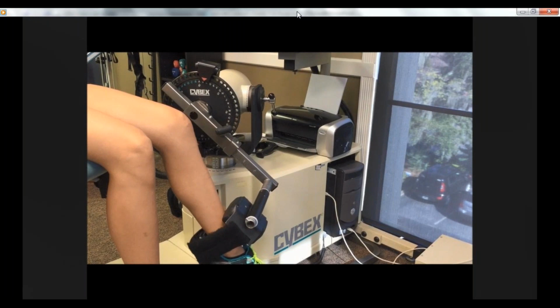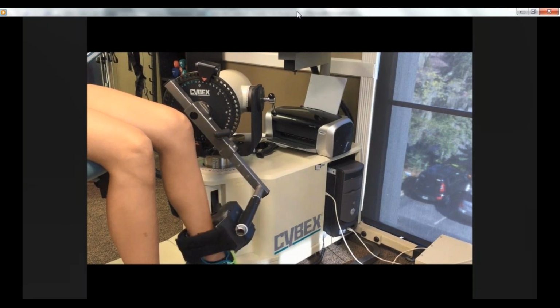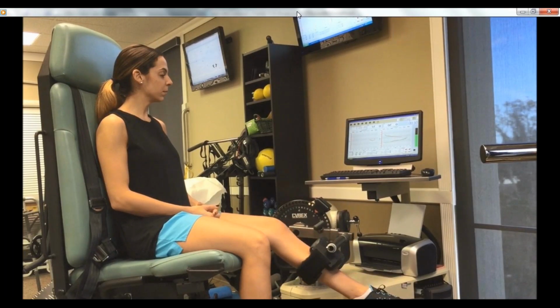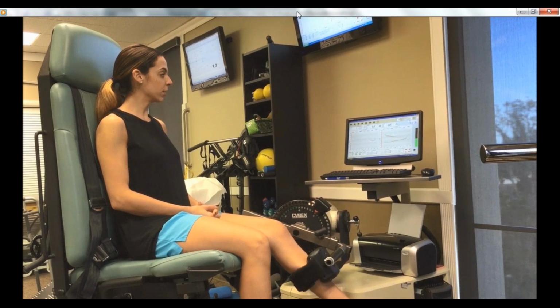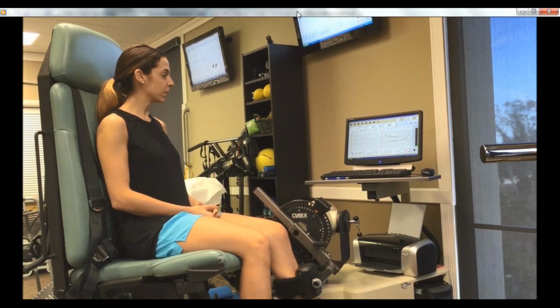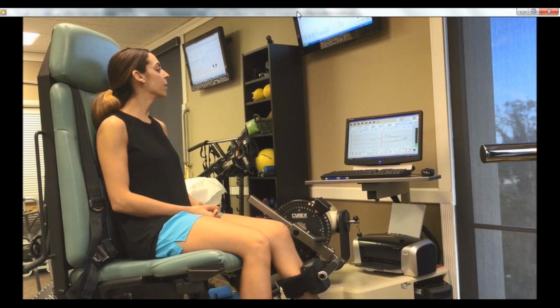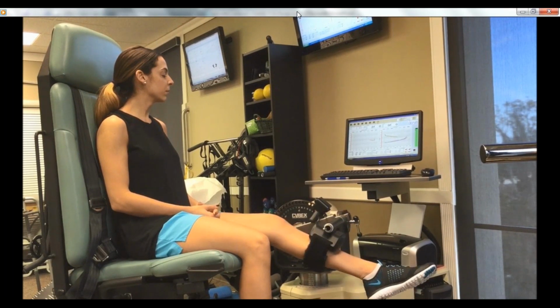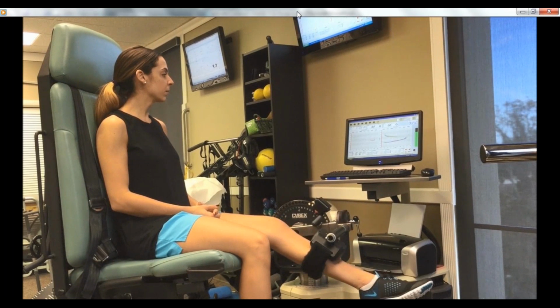All right, so now we've progressed, and she's loading 5 degrees per second eccentrically. She's still going to ride the machine on the way up. She's not going to do any concentric action with this. You can see that we have that adapter arm placed proximally on the tibia. That way we can offload or offset any of that anterior shearing that may occur. It's still very light. We're talking less than 5 foot-pounds of torque.